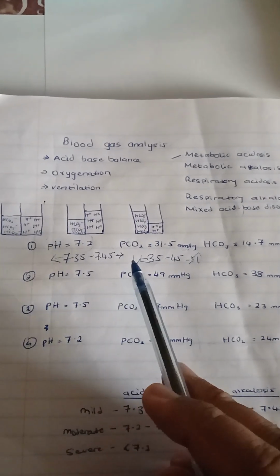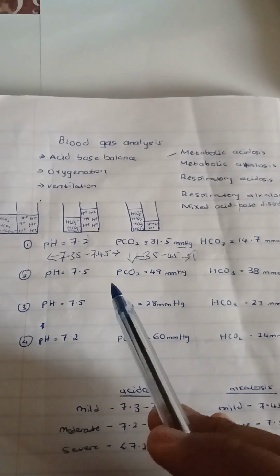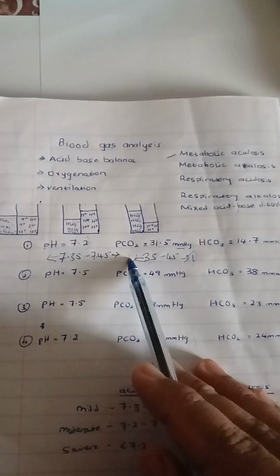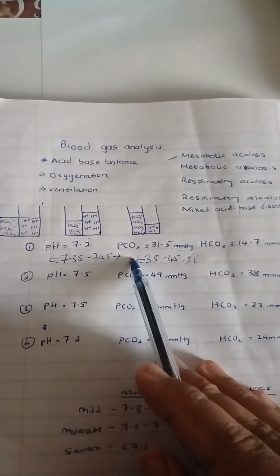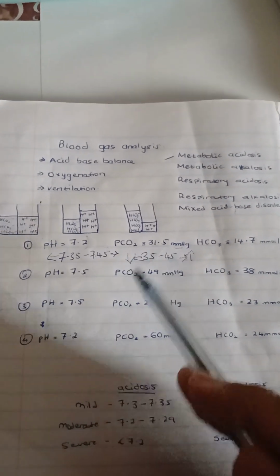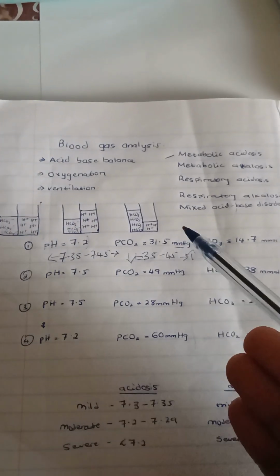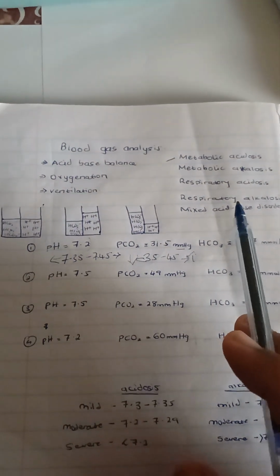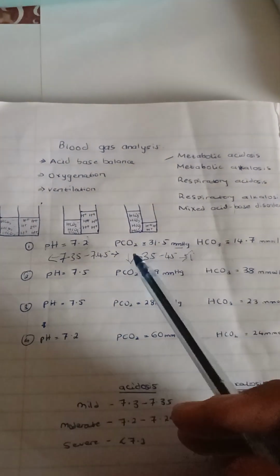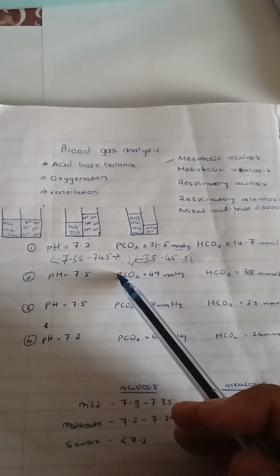It's lower than 35, so it is going towards an alkalotic picture. Either this is the primary problem, in which case the patient will be having an alkalosis. Or the other possibility is that the patient is having an acidosis, but the body is trying to compensate by reducing the hydrogen ions, by reducing the PCO2 to try to bring the pH back to normal. So either it's the primary problem or it's a compensation.